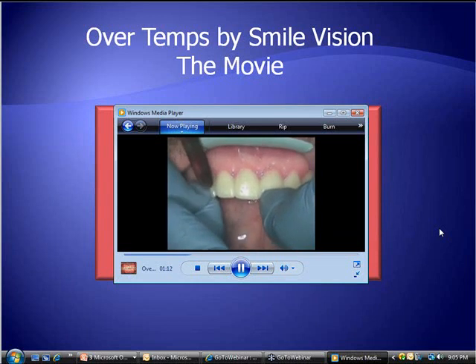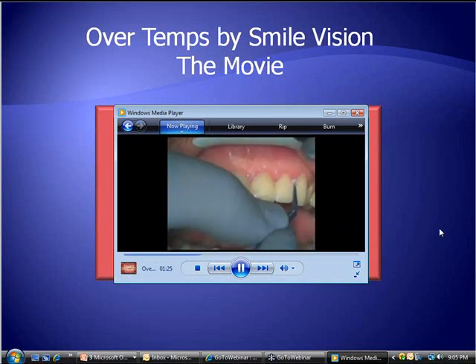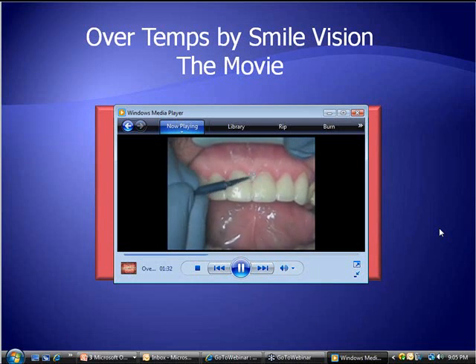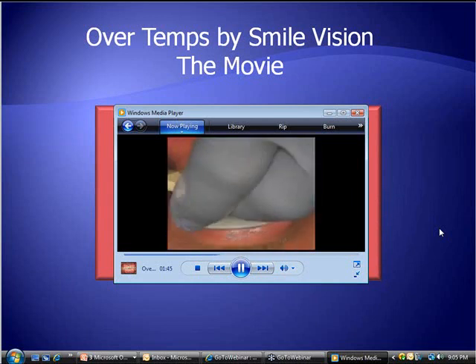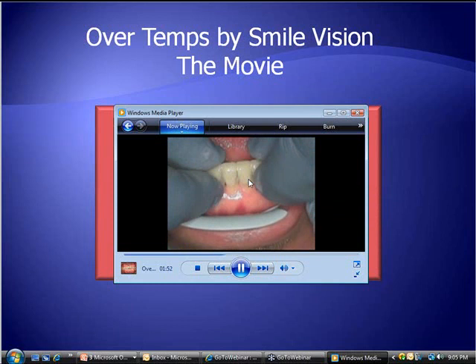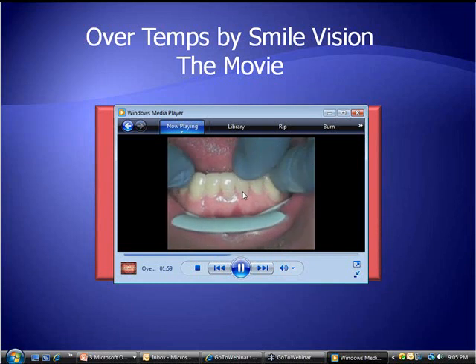Just clean up the excess, and again, spot tacking with that two-millimeter light. Would it be nice if we could do all veneer cases like this — just put six in at a time? Then take away the excess with a microbrush. This is the prosthetic division of Caulk — they make a material called Radica. It's a very dense composite material designed to do long-term provisionals. Lower arch filled up with Calibra and seated all at one time. This is just merely a reproduction of that resin replica mock-up.